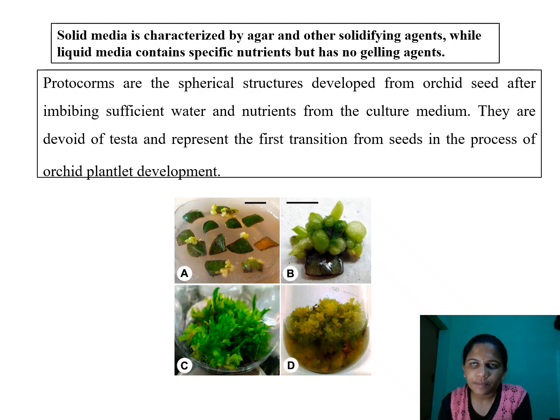So this is about media preparation, components of the media, and the different types of media available, what solidified media is and its advantages and disadvantages, and liquid medium and its advantages and disadvantages. So this is about the entire medium. You have already learned this practical in the eighth practical, so this is a recap for you. Okay, thank you. If you have any doubts, you can ask me.